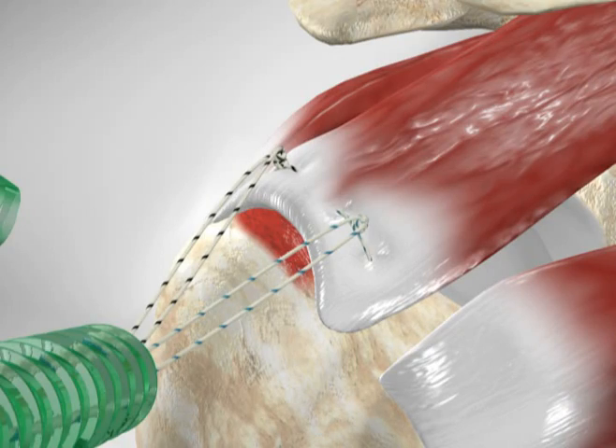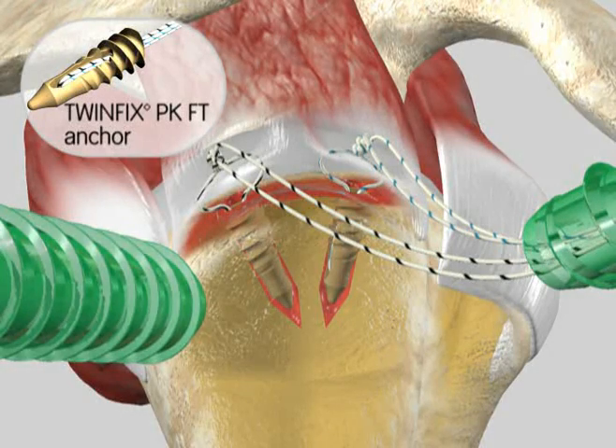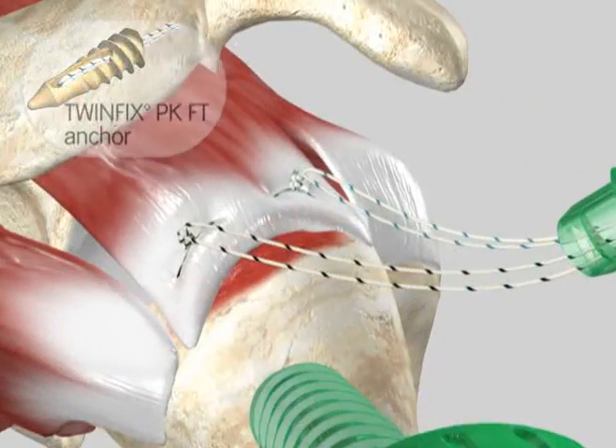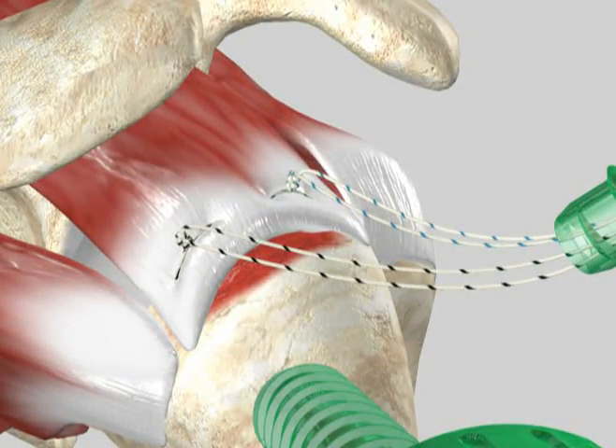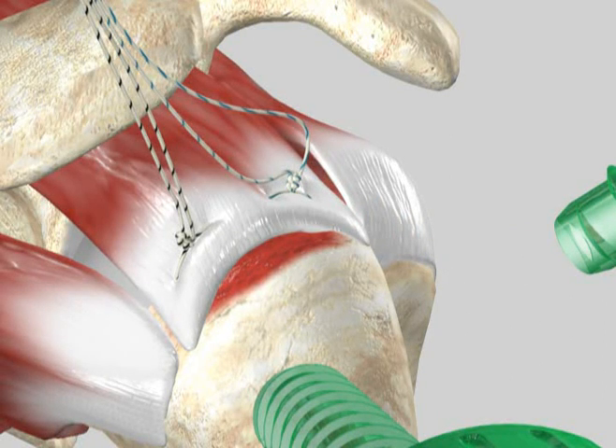First, implant the medial row anchors. We have shown two TwinFix PK fully threaded anchors in this example. For simplicity, we have unloaded one suture from each anchor, so only one suture remains in each. After passing the suture through the cuff and upon completion of knot tying, park the free suture limbs out of the accessory lateral cannula or a stab incision.